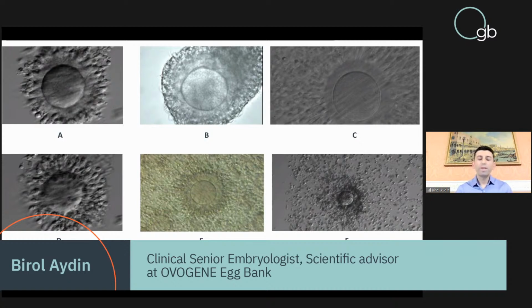As you know, when you collect the oocytes, especially if there are blood clots around the cumulus complex cells, they may affect central granulation and can increase it as well. Second, such a cumulus complex can have a kind of pathologic effect, especially it can stick to the cryostraw. When you try to clean it out, when you try to thaw oocytes, it can cause your oocyte to degenerate. That's why cumulus complex morphology is really important for egg banking.